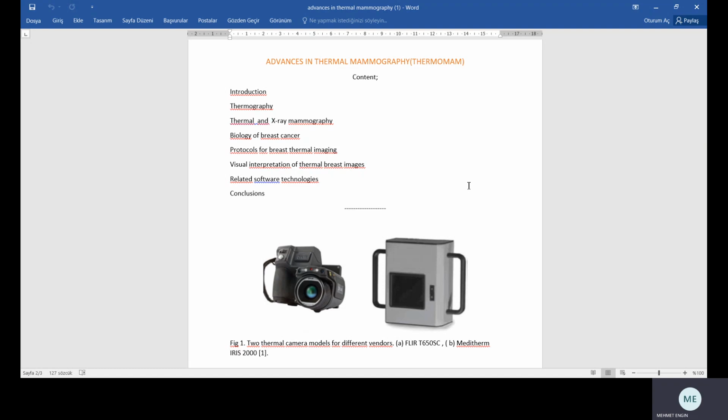The second aspect is detecting the region of interest. The thermal image is captured with the patient sitting about 3 feet from the camera. This captures the thermal signature of the top part of the body of the subject, starting from the neck region. A software tool like Niramai that does automatic analysis of breast cancer has to accurately crop the region of interest, namely the breast tissue region.